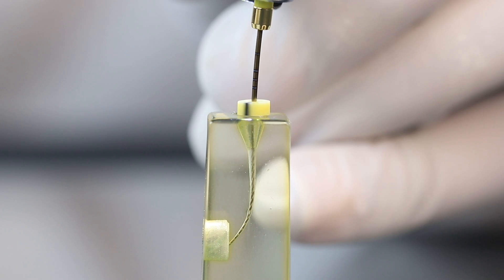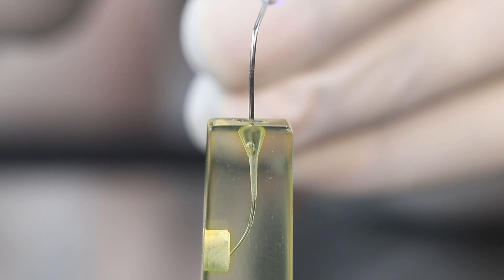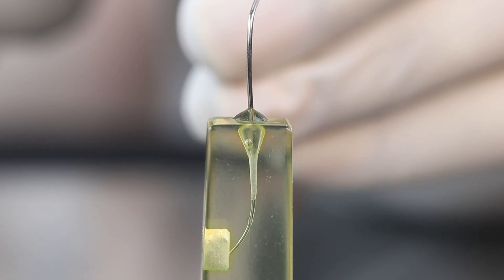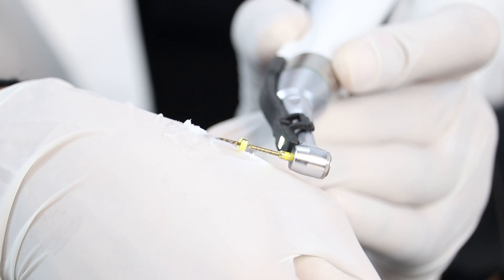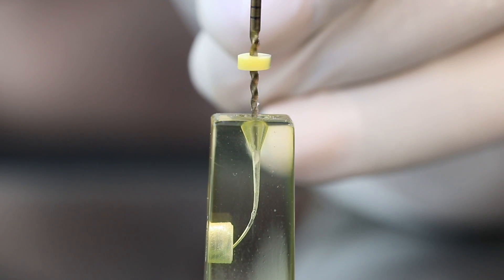We will again use the #15 K file, with which we started our canal preparation, to recapitulate. To establish the glide path, I'll be using the glide path file. We will keep irrigating and recapitulating before switching to another file in the canal.